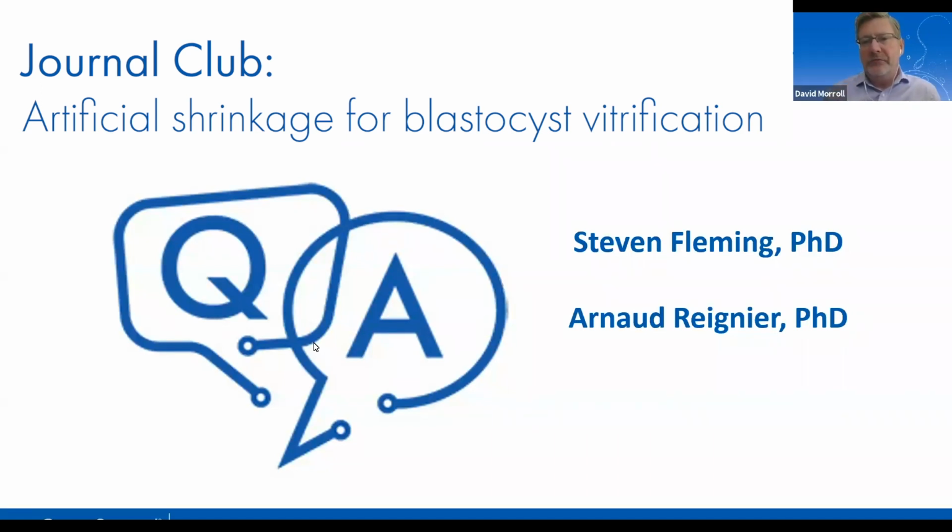Just really to re-emphasize what Arnaud just said, I think that the blastocele fluid is there for a reason, and we know from less complicated animals that it's involved in gastrulation and separating cell layers, and you would assume that it plays some role. I think, as Arnaud has said, that the importance of it appears to be structural, and of course by collapsing during vitrification, we make an assumption that the embryo will re-expand at some point, that whatever function it is there for is recovered. And I think that's an important part, obviously, of post-warming assessment.